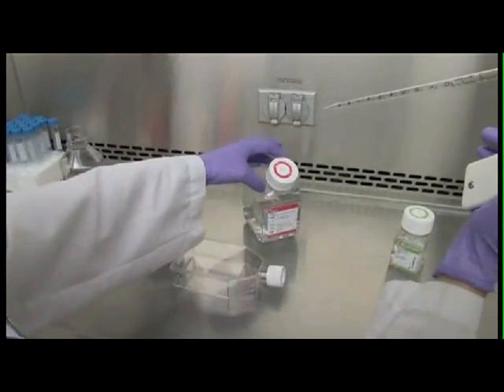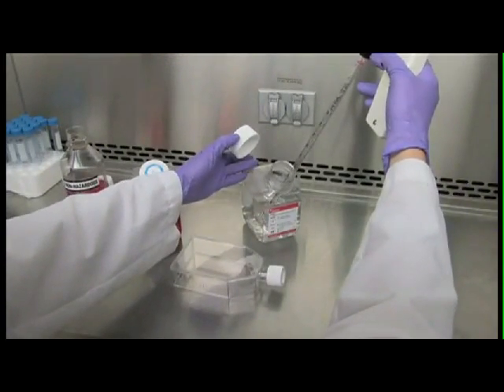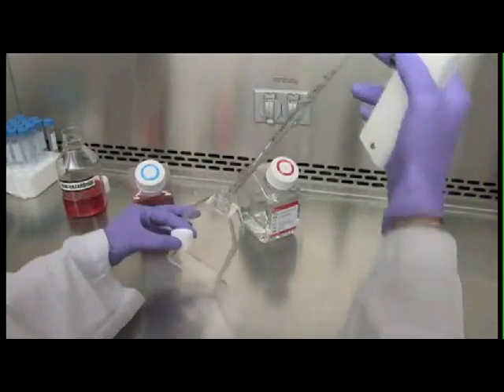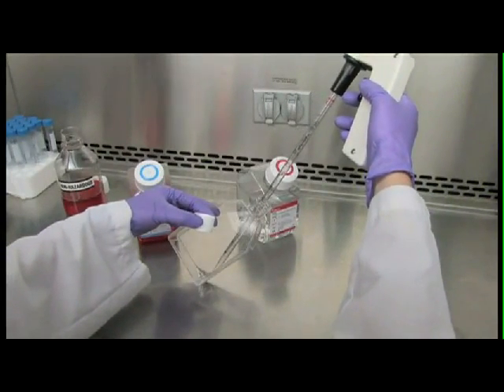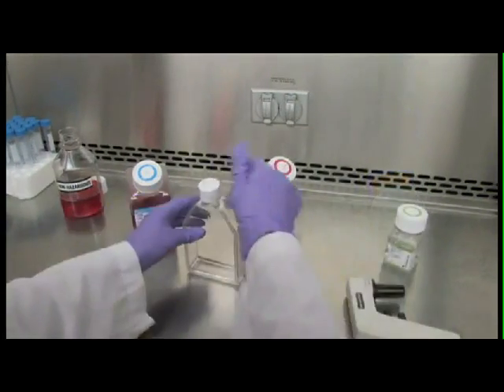Rinse the cells with a balanced salt solution, such as DPBS. Make sure to use a salt solution without calcium and magnesium, as these may inhibit your cell dissociation reagent.